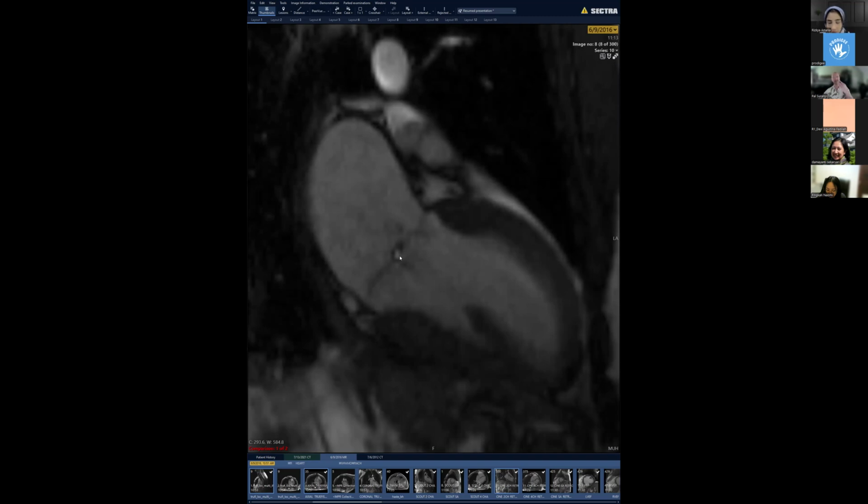The jet is probably eccentric, so it's not shooting exactly in the plane of our image, which is why we see a bright circle with a dark circle around it. It's because the jet is kind of off out of our plane, and we're just cutting through the jet.